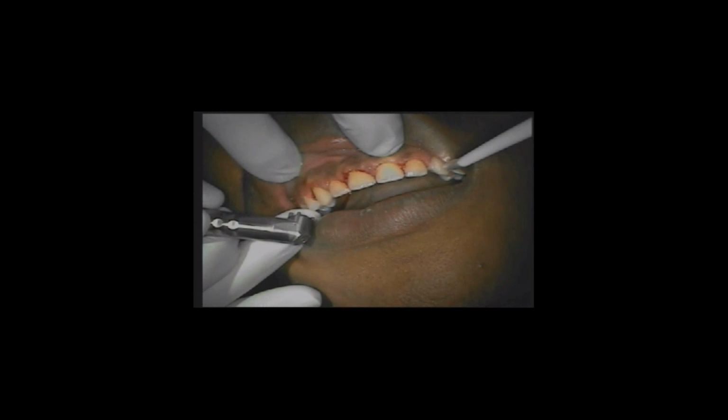So if we stay at 30 hertz, 60 millijoules, and we turn the water on a little bit, our cutting efficiency drops down, which is exactly what we want. We don't want a big change in the tissue height or to notch out a section of the tissue. So it's just really fine-tuning at this point, creating a bevel with very, very low energy and interaction with that tissue.